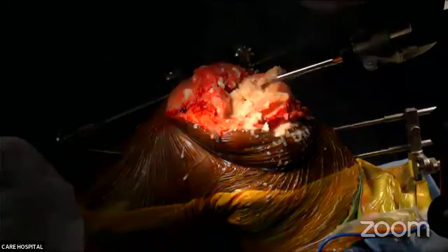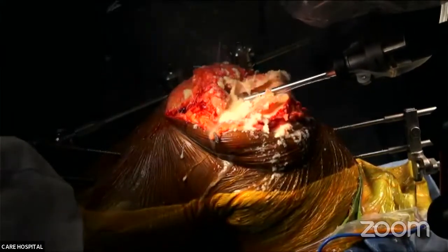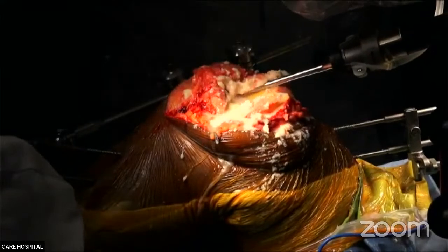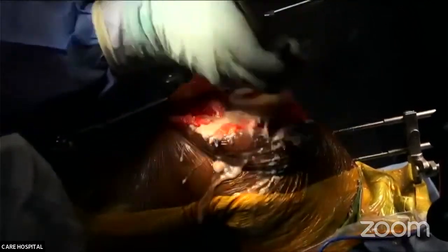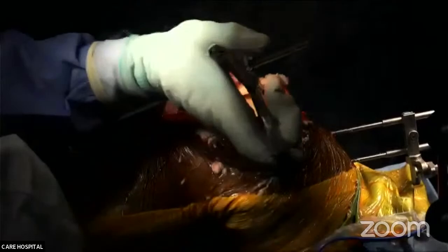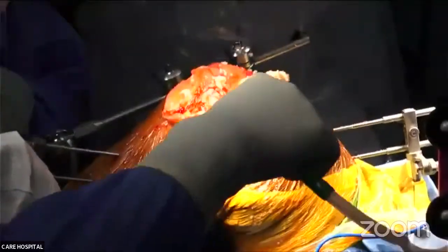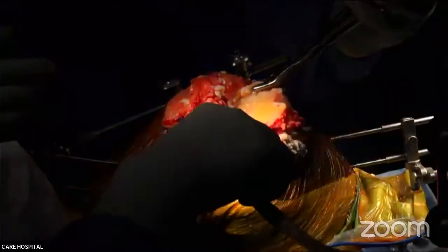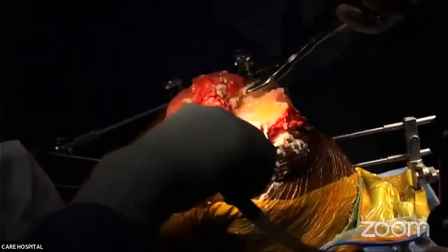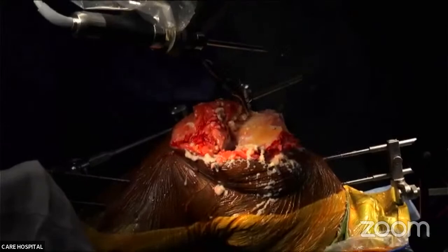Now there is an emergency button always in the hand of the surgeon's assistant, in case something goes wrong, but that is very unlikely. So it has taken the distal cut. Now there is an option that if you want to take just extension cuts, you can take the distal femoral cut and then the proximal tibial cut. You can use the normal 4-in-1 jig for the rotation and the posterior cuts.